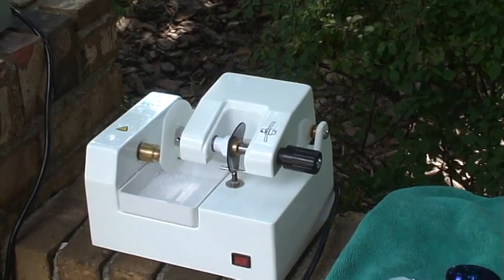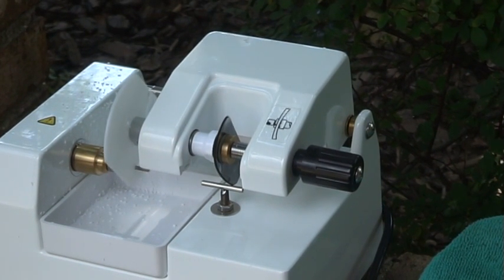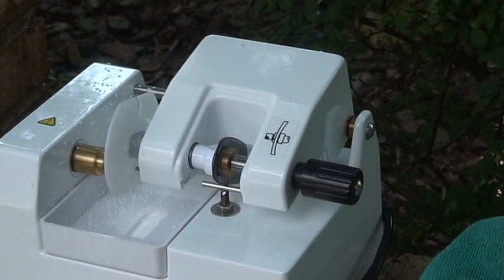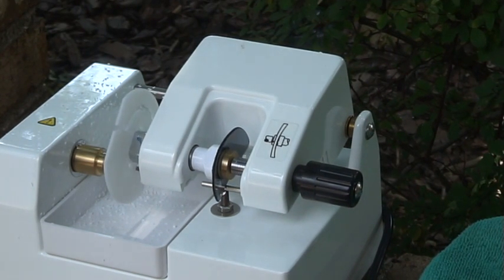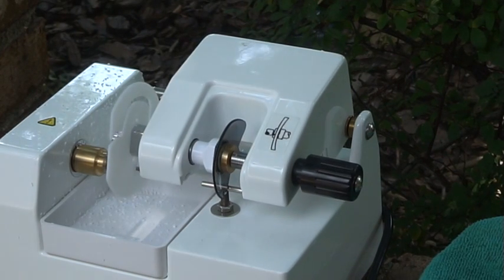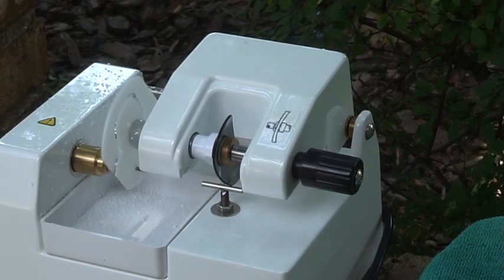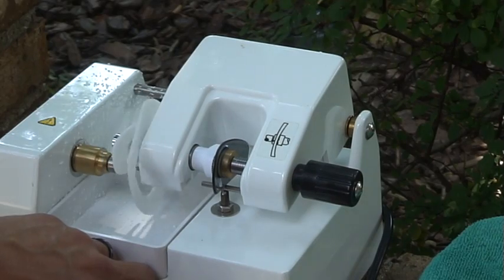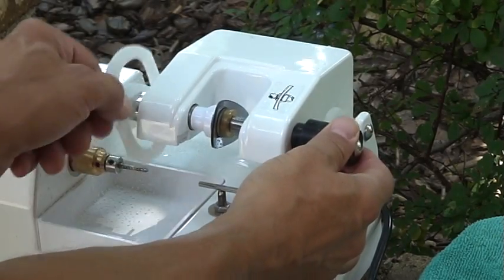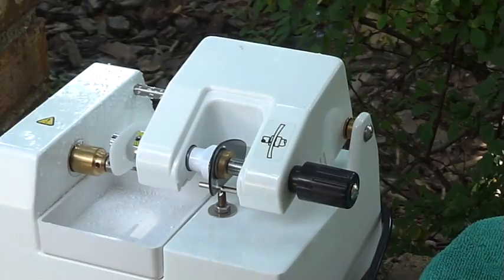Nothing fancy really. Just spins on a, I don't know, a spindle for lack of a better term. Rotisserie, I guess, would be a good word. And you make your pattern from that. And you've got the outside of it, and what you wind up with is a pattern like that.